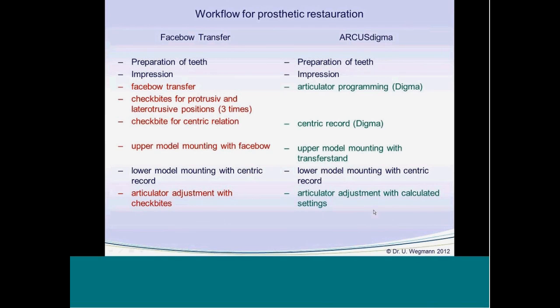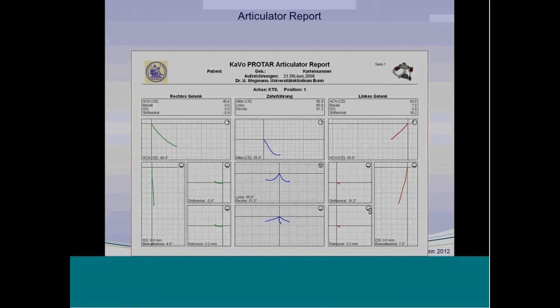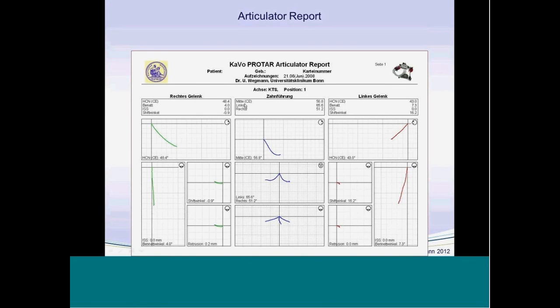And here you can see an Articulator report which goes to the lab. Here you can see the settings, the values for adjusting the right condyle and the left condyle and the incisal point. But additionally to these values, you will find here these curvatures indicating the protrusive movement of the right condyle, the Bennett movement with the Bennett angulation, retrusive paths here for lateral movement and so on.